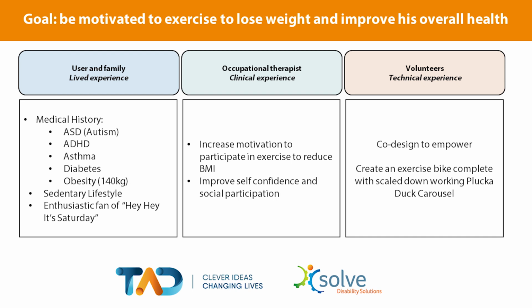So one of the goals that Chris identified is to return to outdoor cycling. He reports that the last time he rode a bike was about 20 years ago. He hasn't been doing bike riding because of his weight, and he has lack of confidence doing this activity.